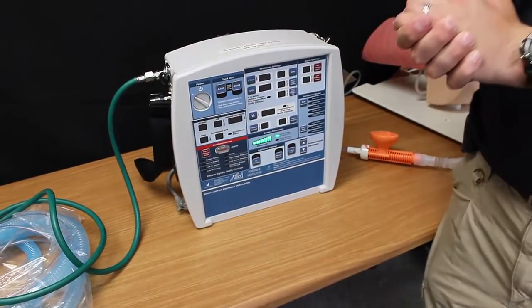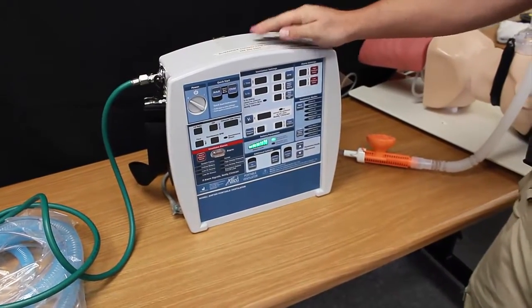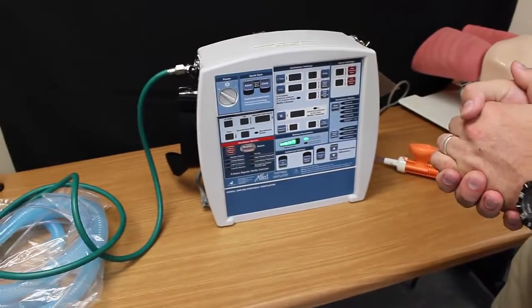Welcome back to Suwannee County Fire Rescue Training Division. We have here the Allied Ventilator AHP 300. Today we are going to talk about achieving BiPAP with this ventilator.